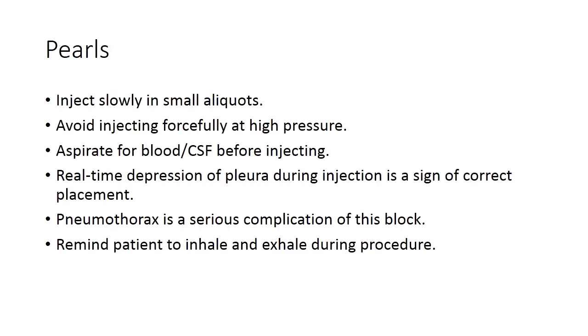Local anesthetic should be injected slowly in small aliquots. Avoid injecting forcefully at high pressure to reduce the risk of epidural spread. Aspiration for blood should always be carried out before injection of local anesthetic solution.